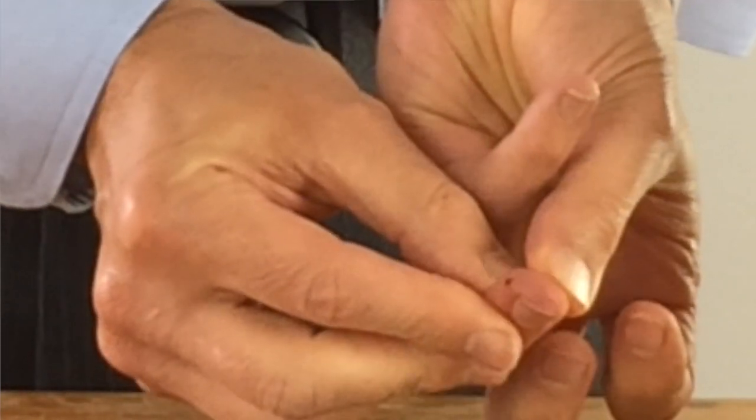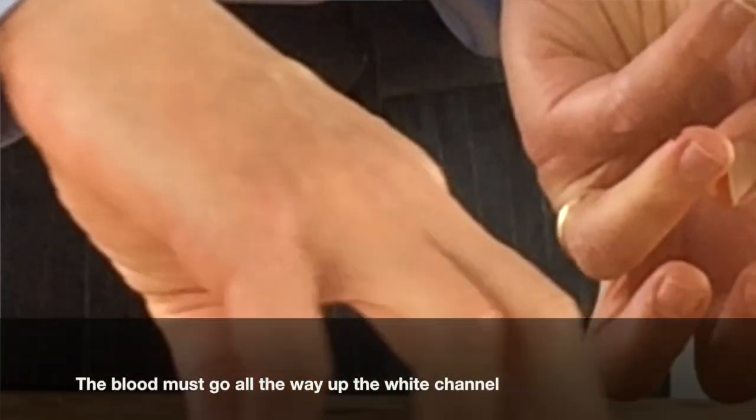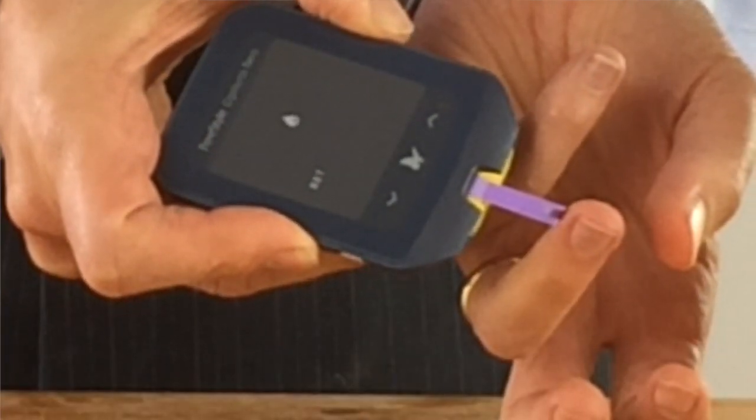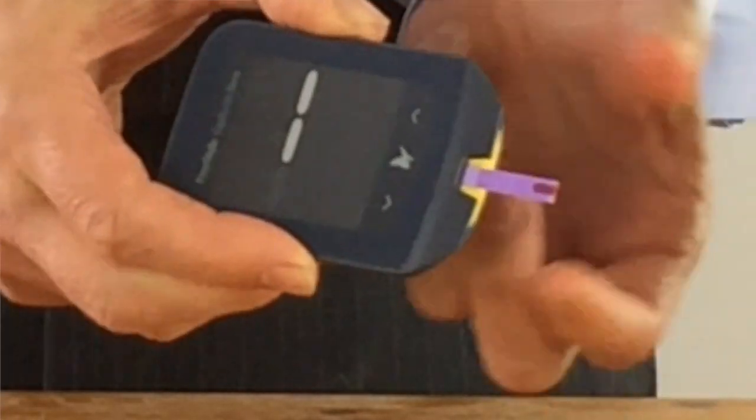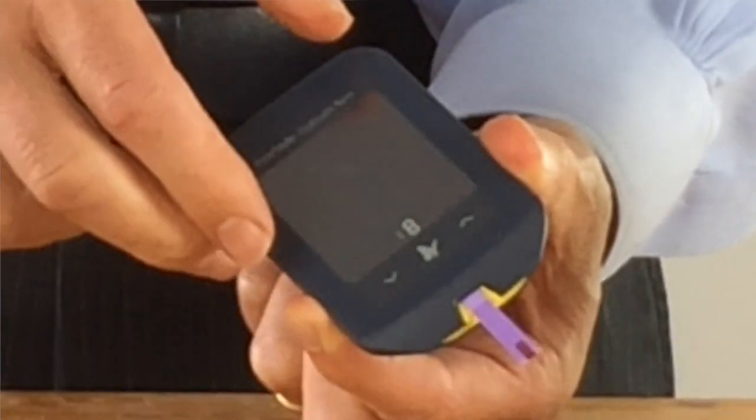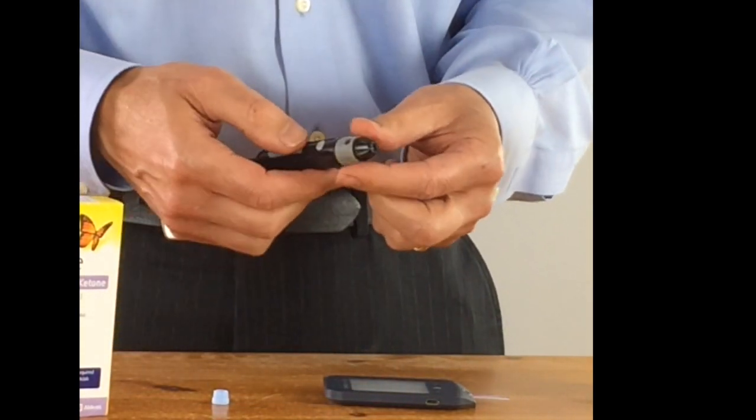You'll get a small well of blood come up. You touch that blood against the white strip of the meter until such time as you see the three lines come up over here. There'll then be a countdown that tells you 10, 9, 8, 7, 6 to get to 1.